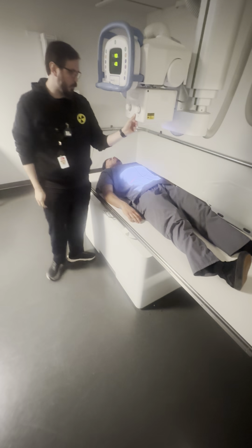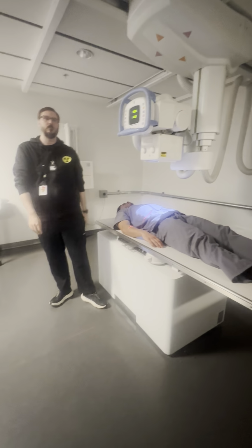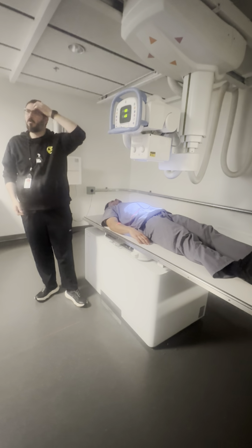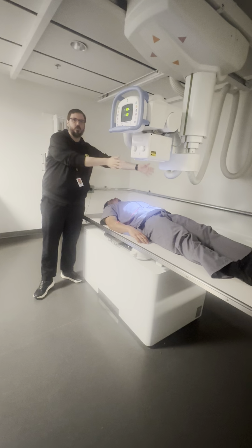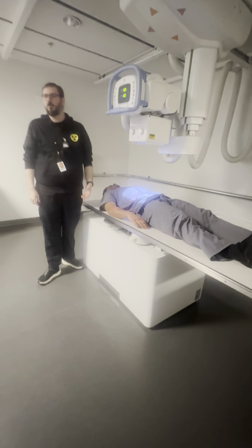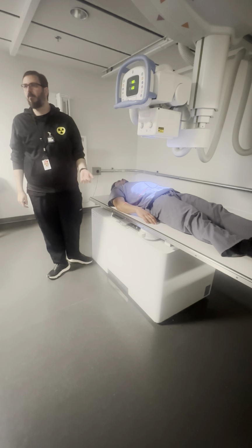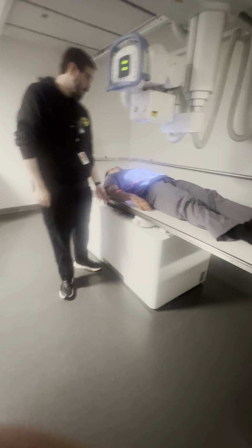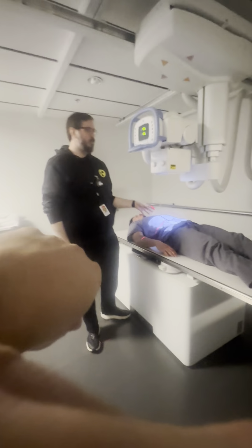I'm going to use my whole board. Sometimes people my size, Alan, Ryan, you might have to do 2. You might even have to do quads, like we've worked on large football players where we had to shoot every part to get them. So what was like a 5-shot exam before becomes like a 10-shot exam or something like that, right? So for this one, I have an initial and I have a delay.